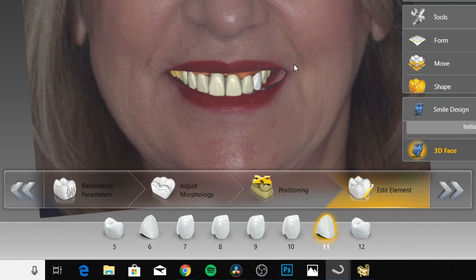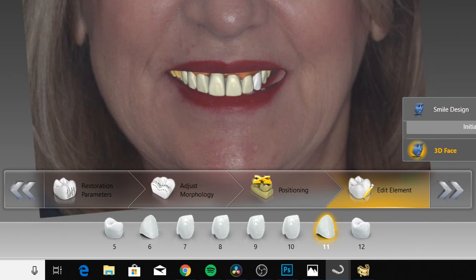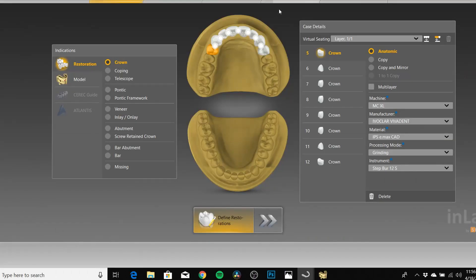Once you've got your design where you want it, you're gonna go into Administration. One thing I forgot to mention: in the design phase, make sure all of your contacts are green — or even maybe slightly out of contact. You definitely don't want any yellow or red color showing on the interproximals, because when you go to the model creator module it will cause issues.